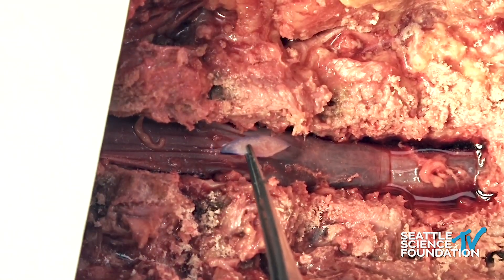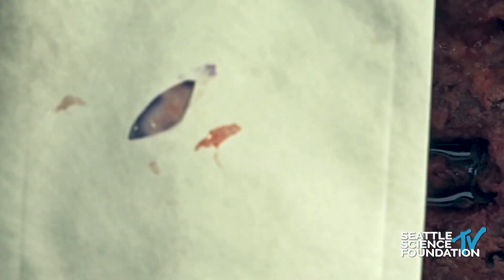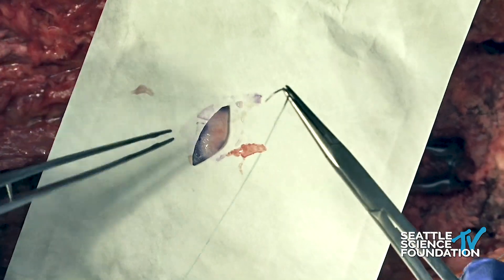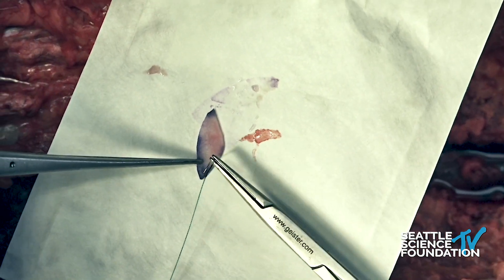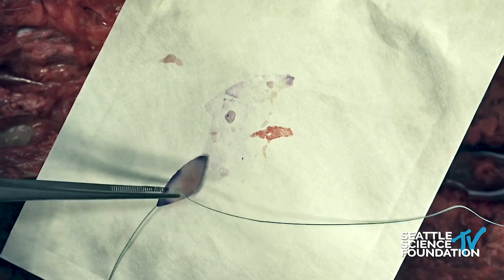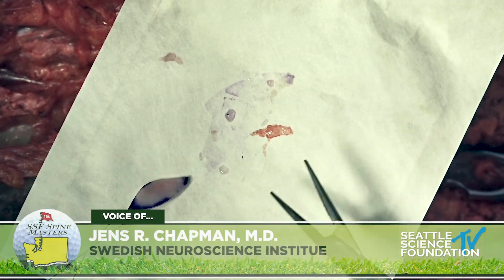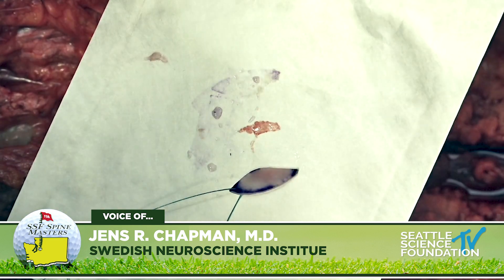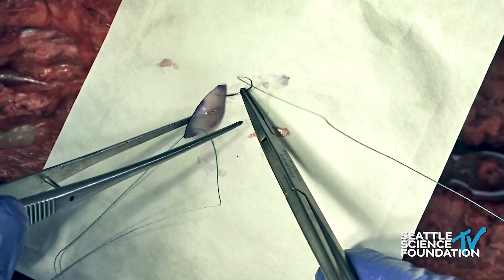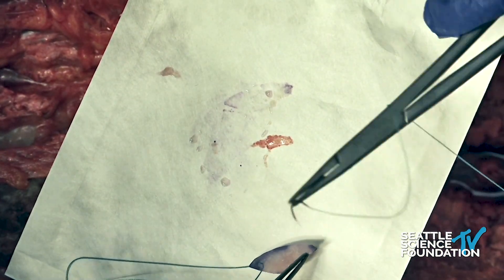What I like to do to repair and suture in this graft — we have an Ethibond suture on an RB-1 needle. Put a suture through the apex. What's the ideal suture material — is it 4-0 nurolon, is it 6-0 prolene? I've gone both ways. I started with 4-0 nurolons and currently I use either 5-0 or 6-0 prolene. I do find that the monofilament with a small needle tends to be more gentle on the native dura.